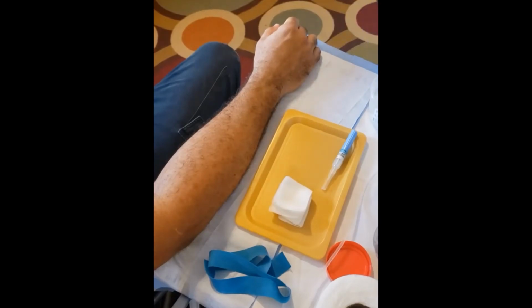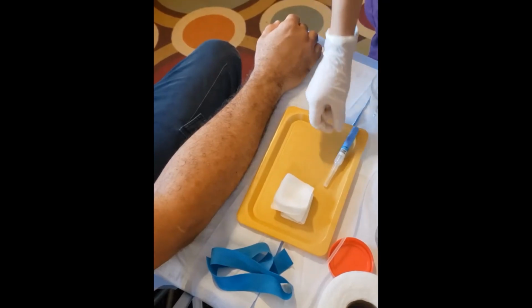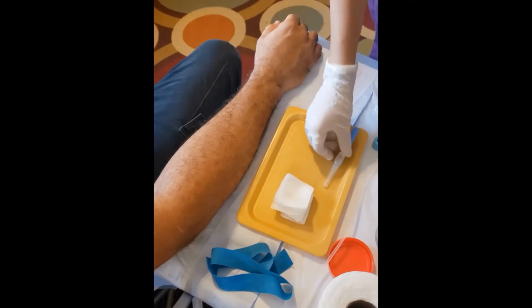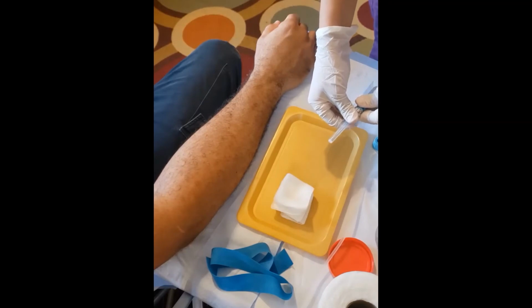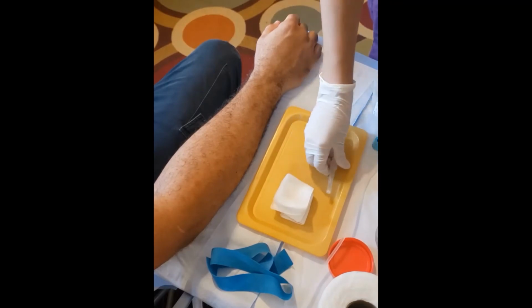Perform hand hygiene and observe other appropriate infection control measures. Prior to performing the procedure, introduce yourself and verify the client's identity using whatever kind of protocols exist for your institution. Explain to the client what you are going to do, why it's necessary, and how he or she can participate. Make sure that the client's clothing or gown can be removed over the IV apparatus if necessary. Select a venipuncture site using the non-dominant arm if possible.